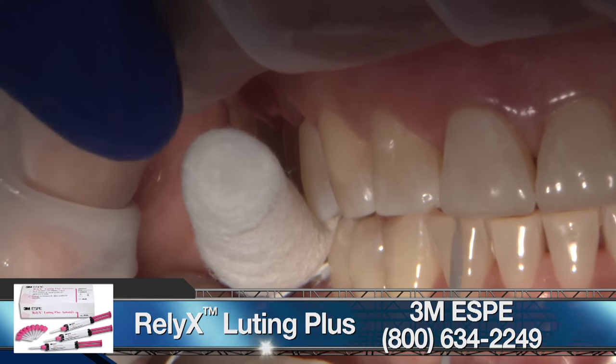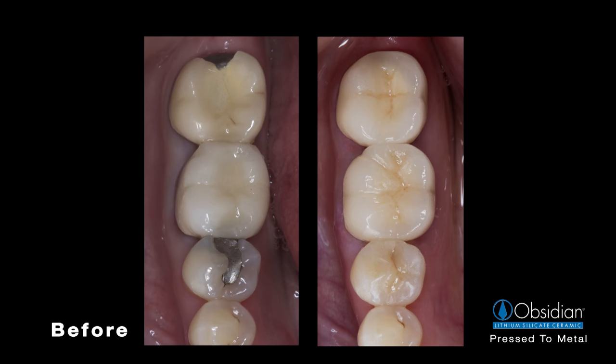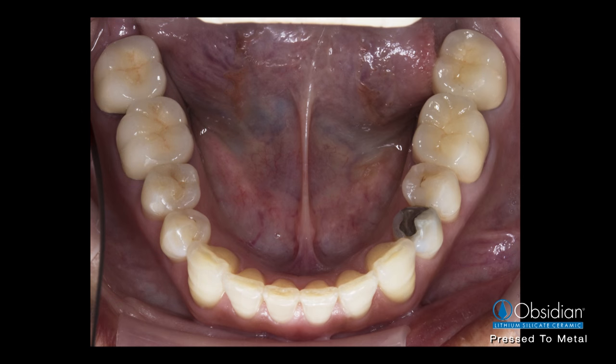These PFMs made of Obsidian lithium silicate ceramic pressed to metal have great strength and are particularly suitable where traditional PFMs failed. This Obsidian combo restoration enabled good aesthetic results to be achieved, and the patient was very happy with her smile. I hope this video showed you the importance of providing a full arch impression when there is no occlusal stop distal to the prepared teeth.